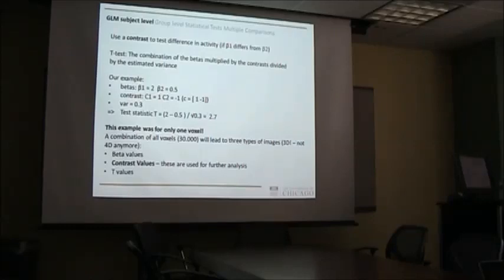It's a time series. And what you're trying to do with this whole model fitting on the subject level is collapse across this time dimension. If that makes sense, right? You have this whole time series and reduce that to a value of how well your model fits this time series.